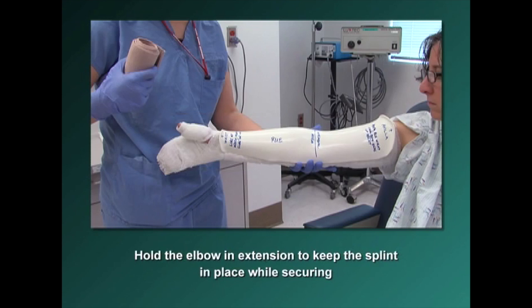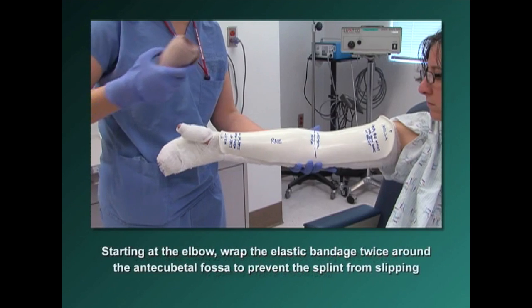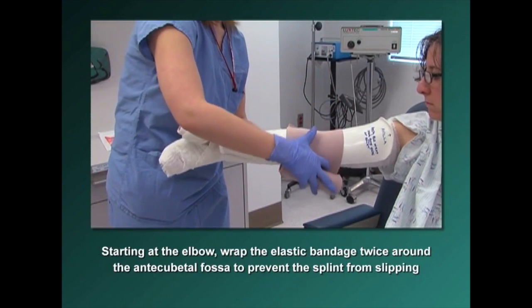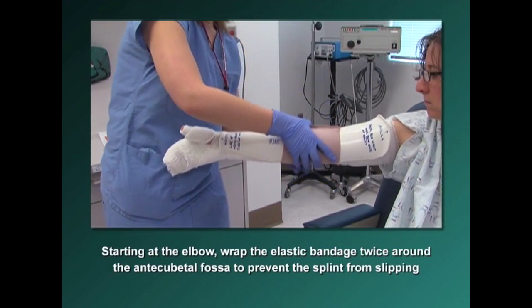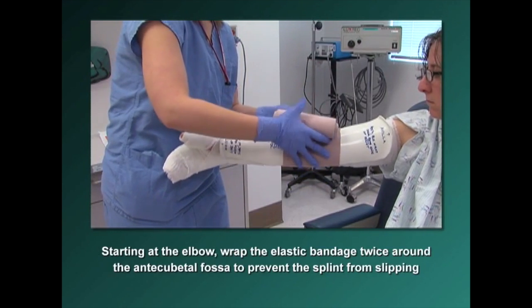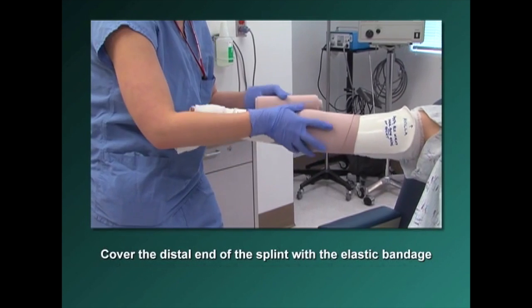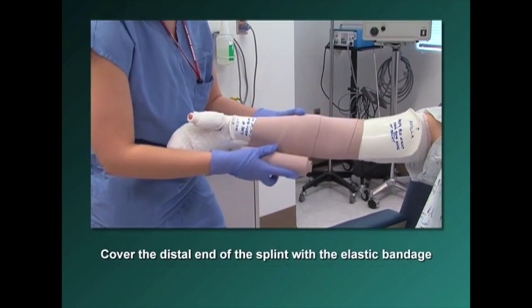Hold the elbow in extension to keep the splint in place while securing. Starting at the elbow, wrap the elastic bandage twice around the antecubital fossa to prevent the splint from slipping.